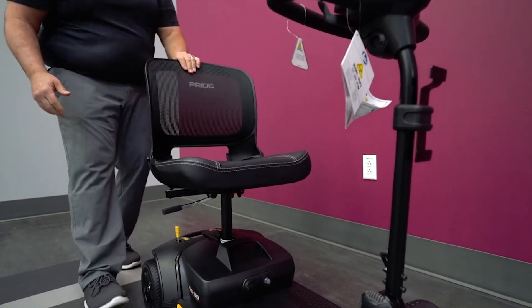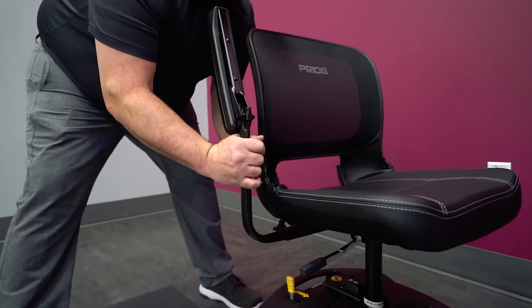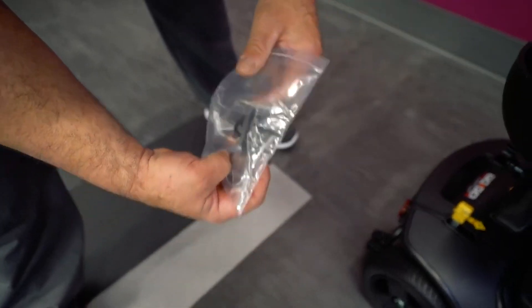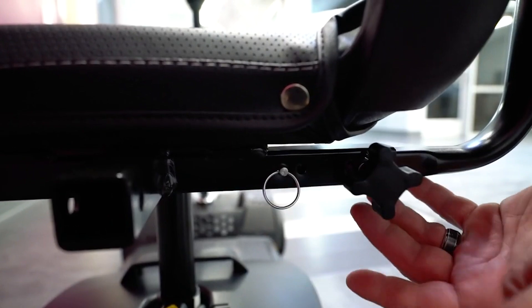Unfold the mesh seat back. Loosen the knob on the armrest holder under the seat and insert the armrest. Secure it in place with a pin fastener and tighten the knob. Repeat this process for both armrests.